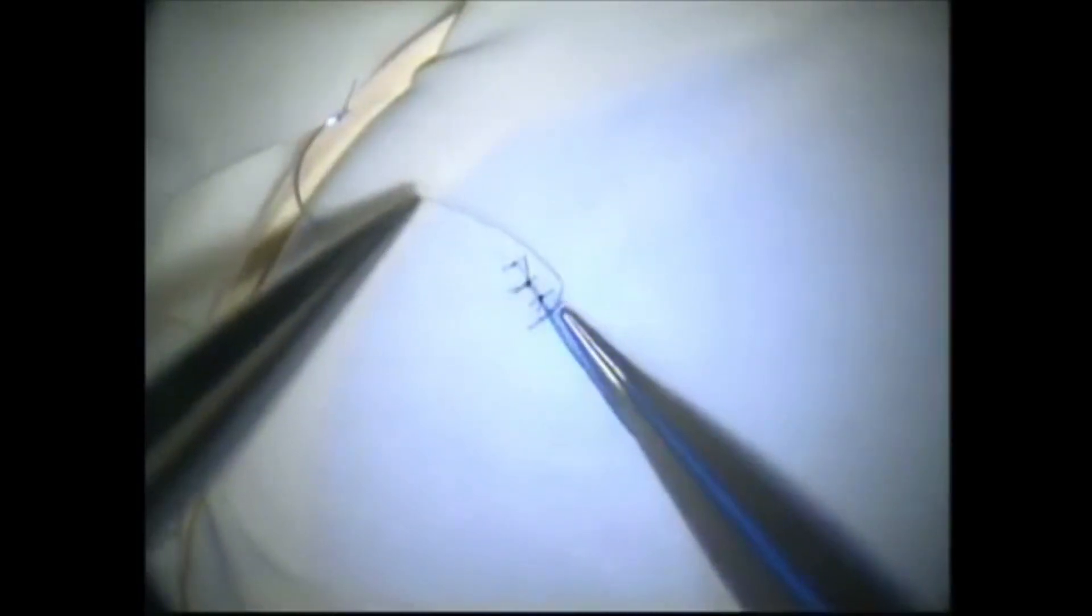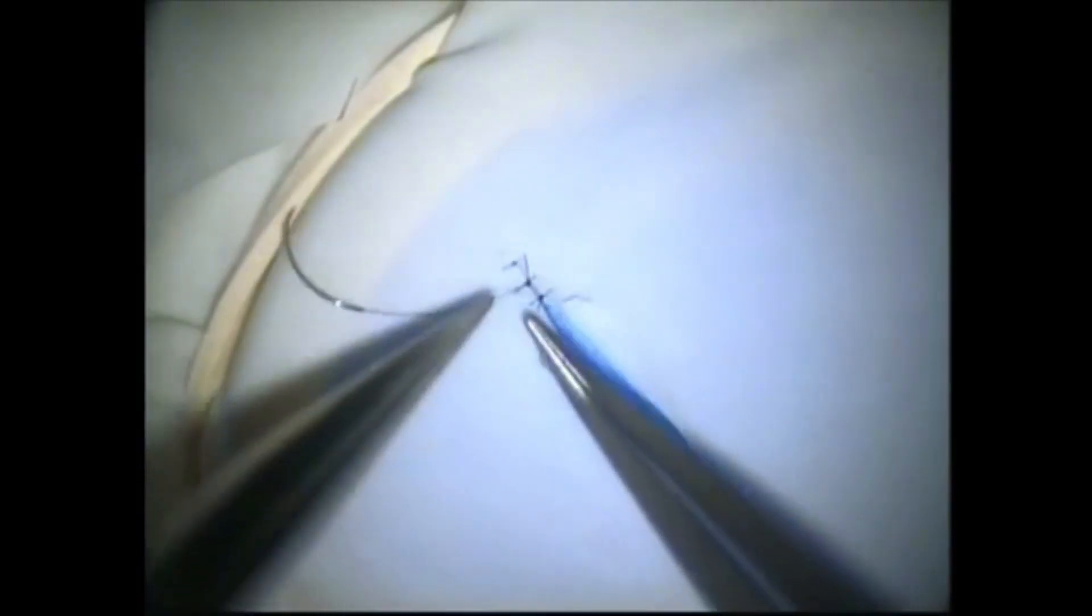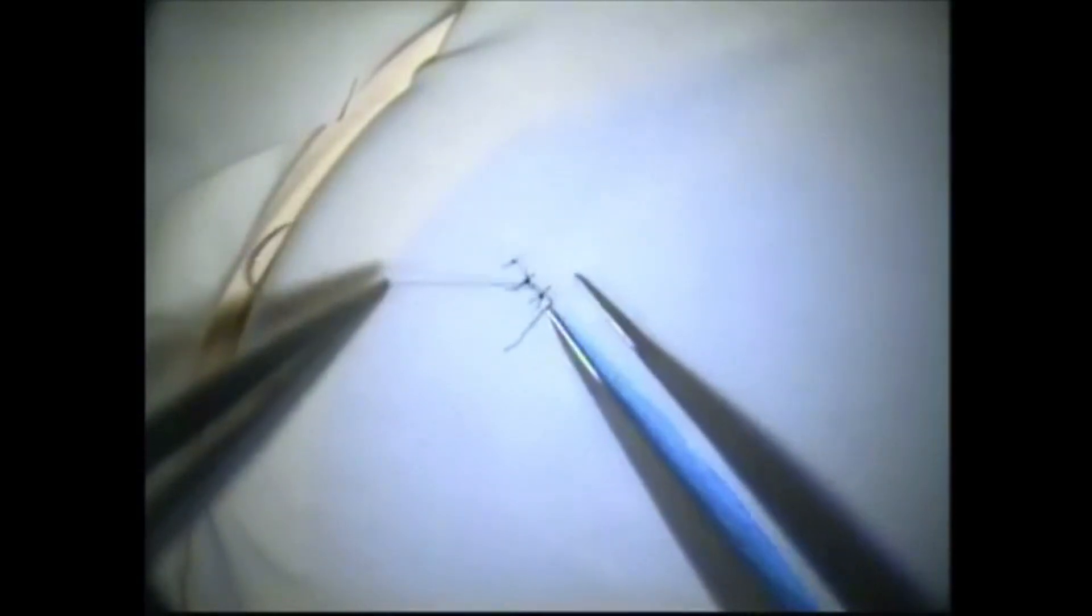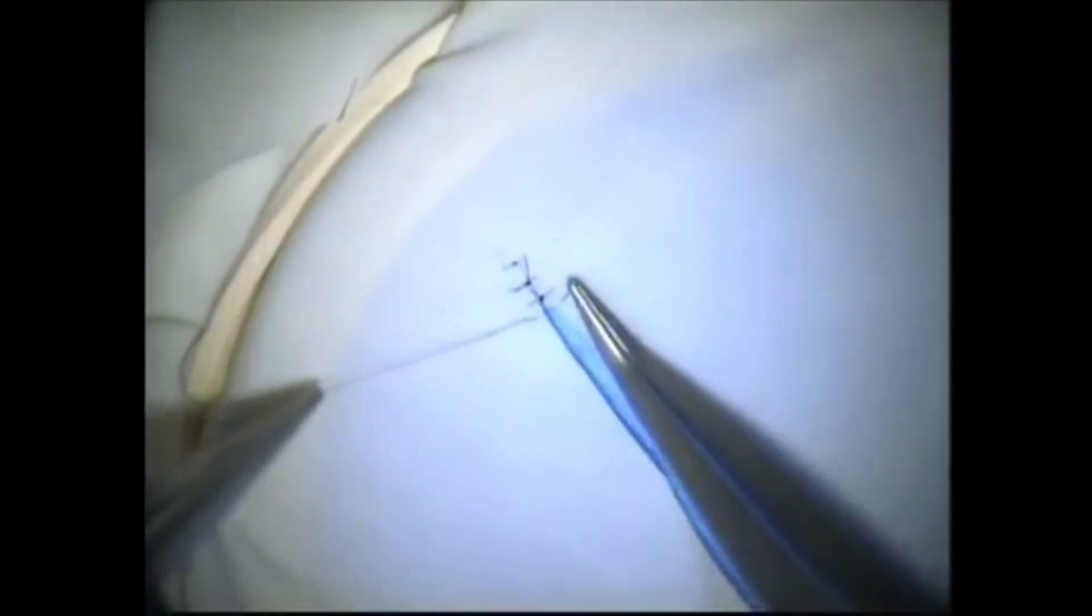If there's a tendency for the edges to spring apart, we can do one of two things. Either we can make a surgeon's knot on the first one and grab that and lay it down that way, which will snug it down quite nicely, or there's another technique that can be used to lay the knot down and keep it from separating the wound edges.